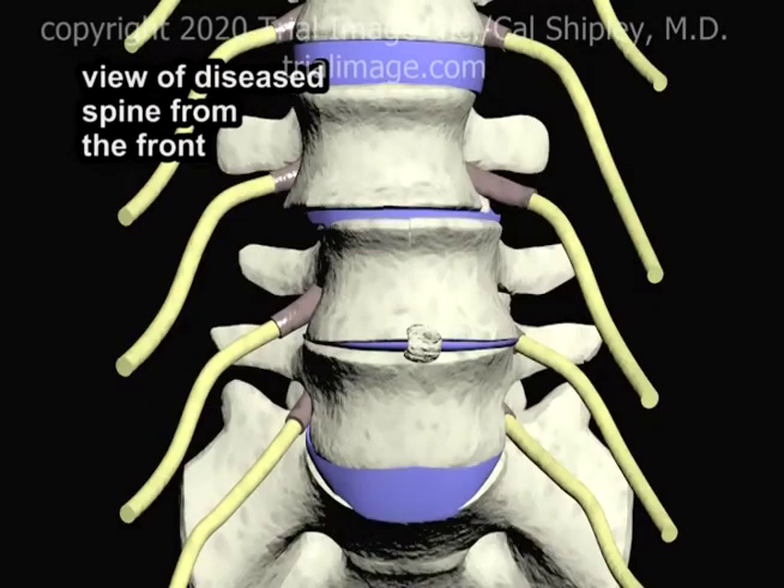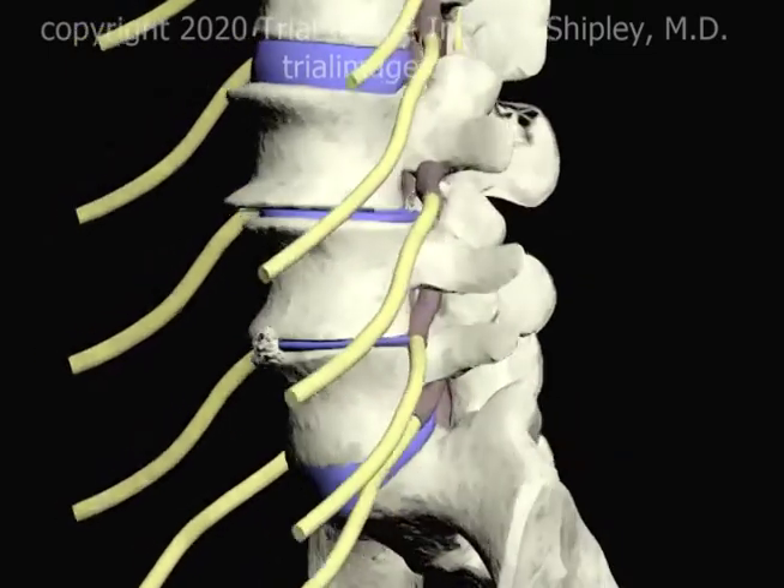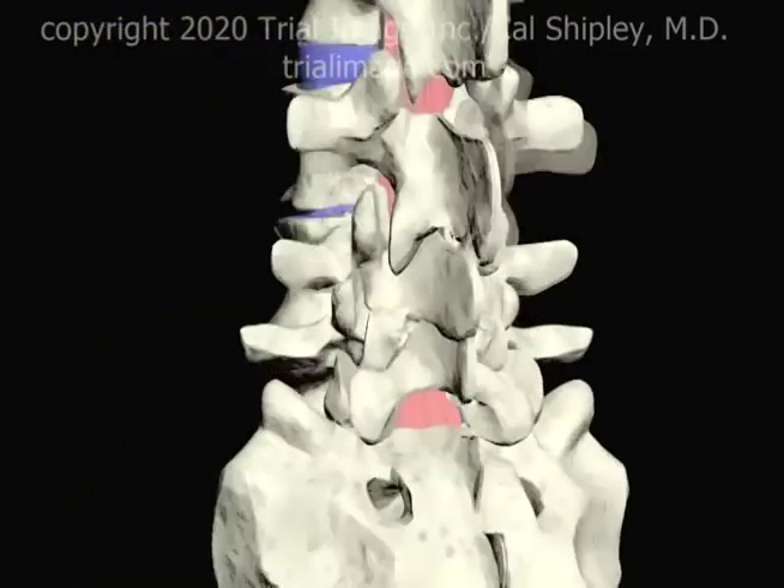Here is a view of the diseased lumbar spine that we are going to be using in this presentation. The intervertebral discs at L3-4 and L4-5 have completely collapsed, while the L5-S1 disc is partially collapsed. Let's rotate our view 180 degrees so we can see the back of the spine.